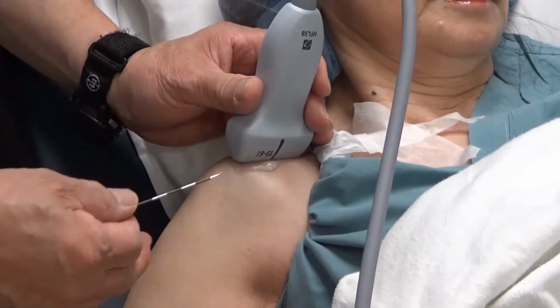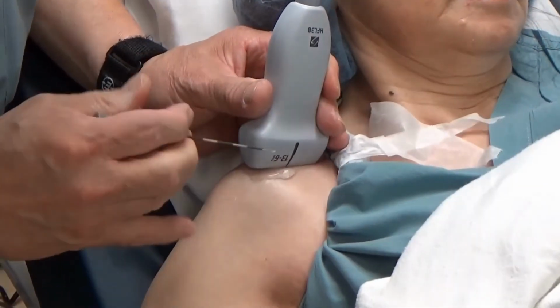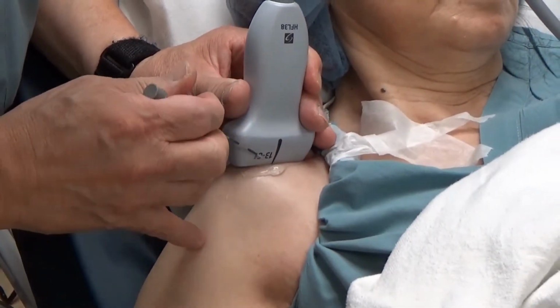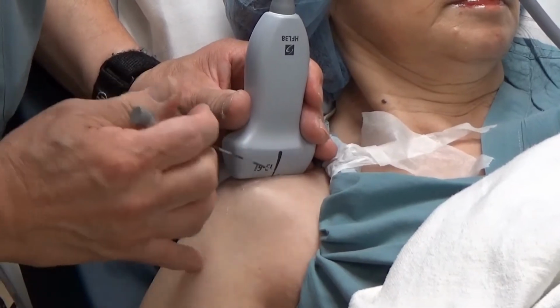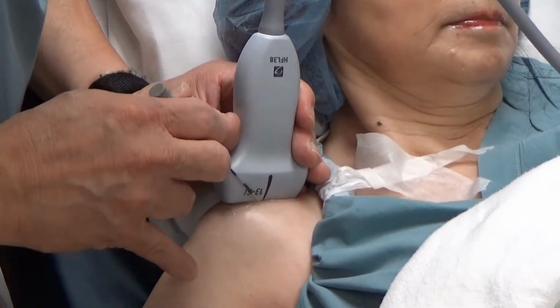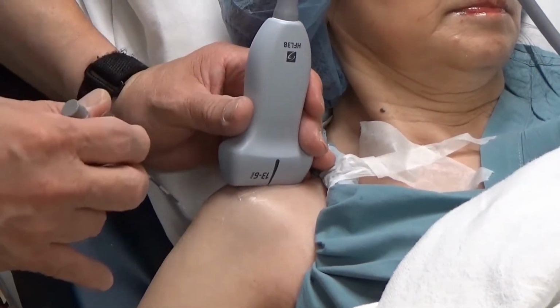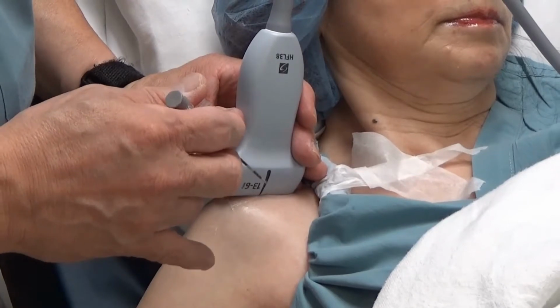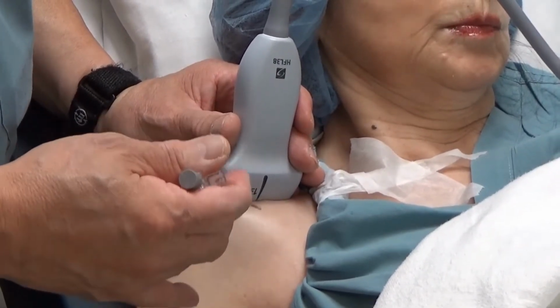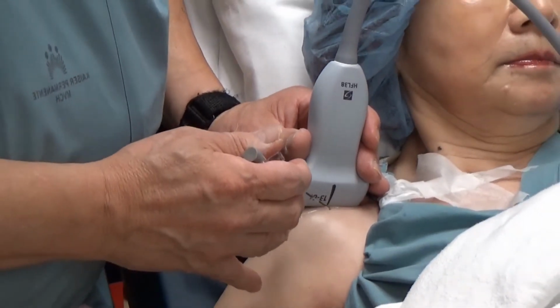You can, if you prefer, also use an out-of-plane technique, and here we'll simulate the out-of-plane technique. Again, the skin is first anesthetized, and then I would use my needle in this out-of-plane technique. In my actual practice, I find it's helpful to use both because some areas of the calcium deposit have better access using the out-of-plane technique.